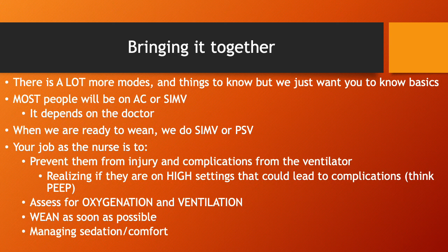Most people are going to be on AC or SIMV, so those are the modes to understand the most. It really depends on the doctor. In the hospital that I work in, all of the medicine patients are on AC, all of the surgery patients are on SIMV, and that's a doctor preference. So it isn't always about their readiness to wean. You're going to learn more of this as you go on, and it's going to depend on your facility. But right now, at this level, I'm going to try to simplify on the next slide generally what we use these modes for.